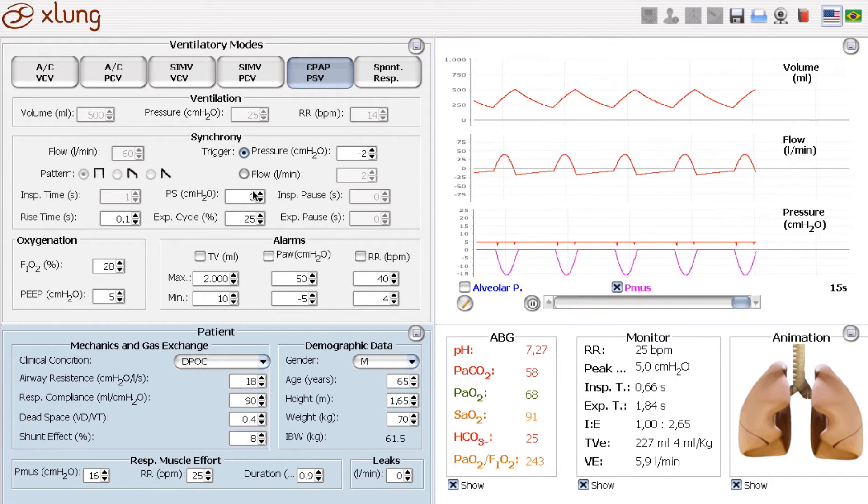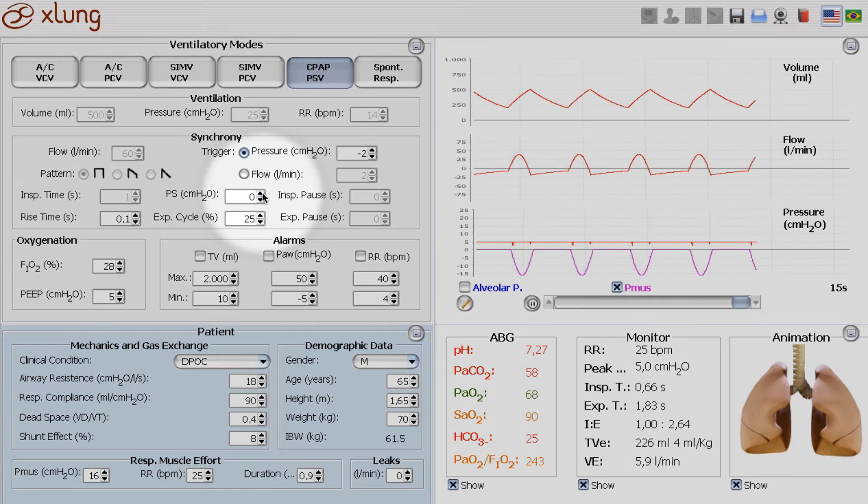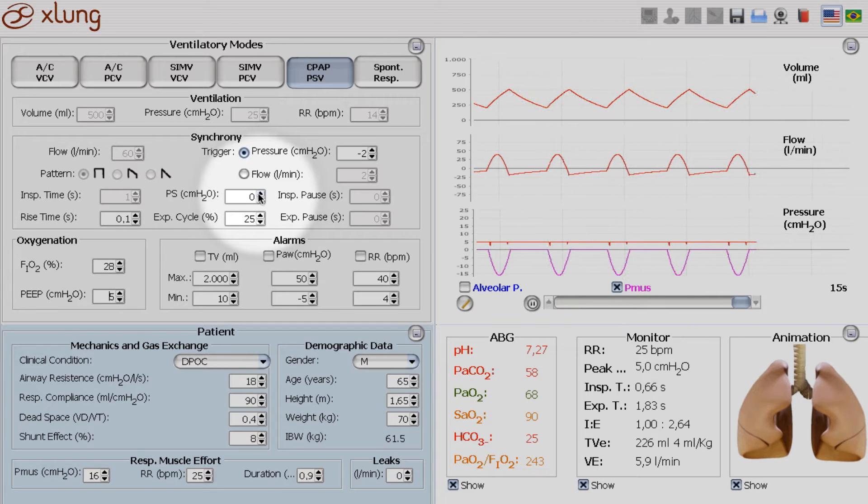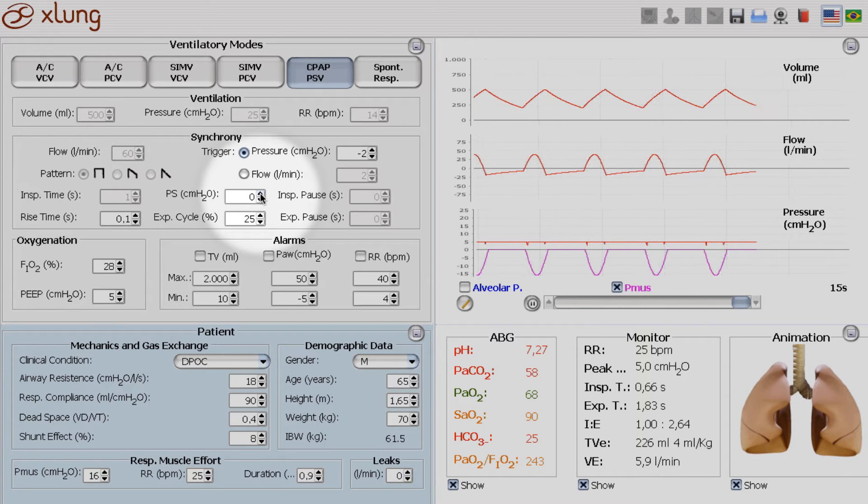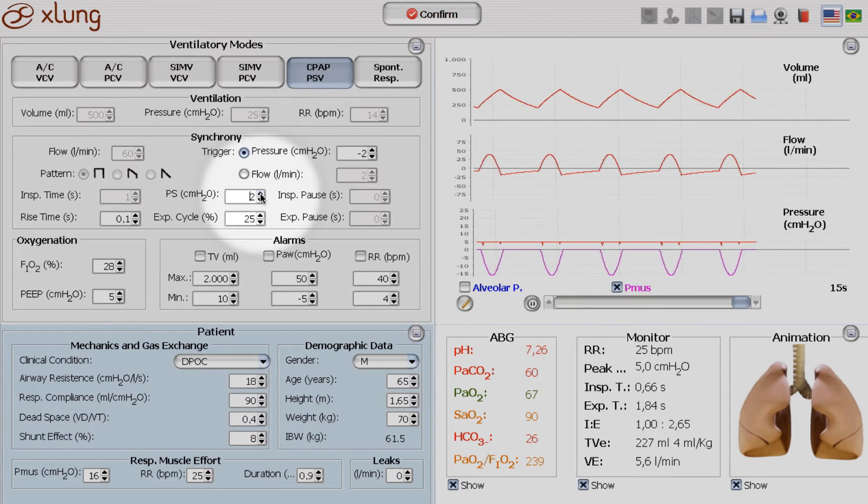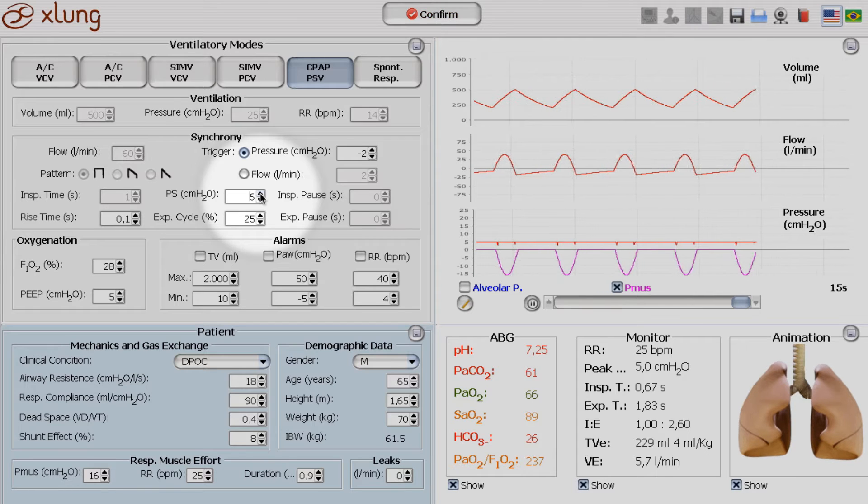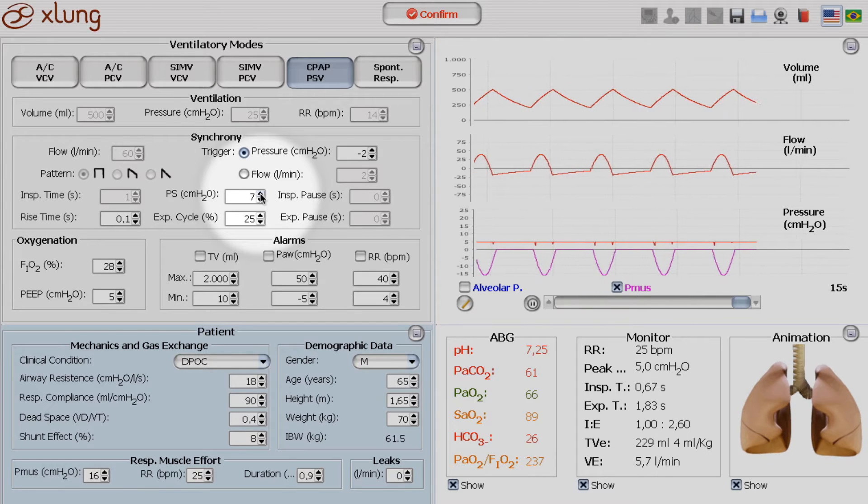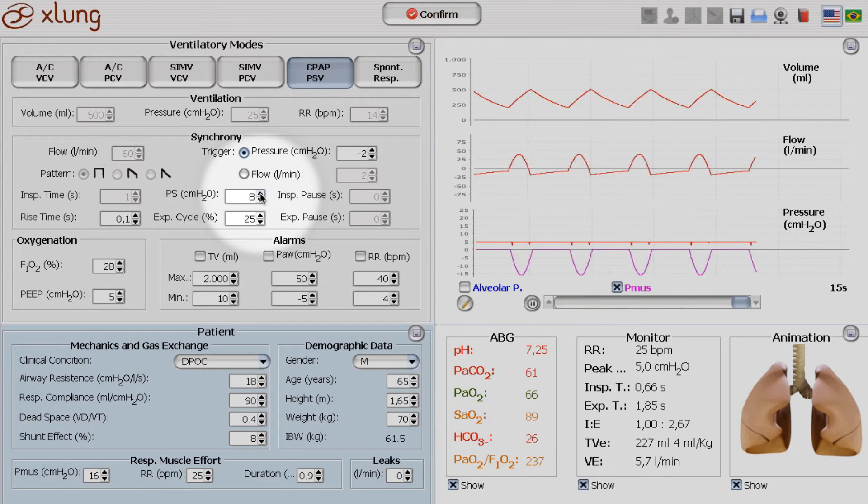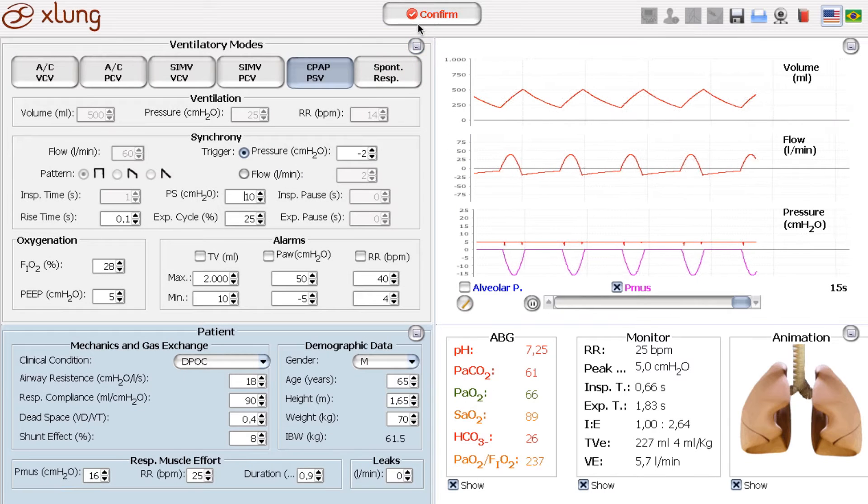Well, it is now that we can improve it by giving him some more pressure support. I'll give here 10 cm of water of pressure support. And let's see what happens.